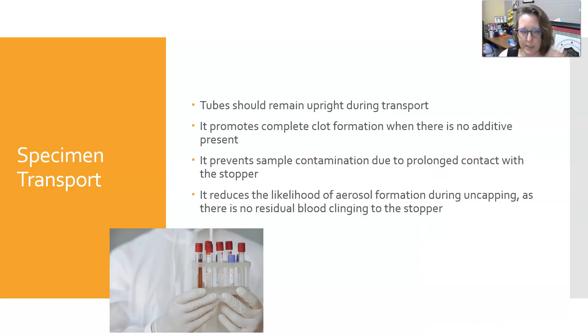Specimen transport itself: the tube should remain upright during transport. That promotes complete clot formation when there is no additive present. It prevents sample contamination due to prolonged contact with the stopper. It also reduces the likelihood of aerosol formation during uncapping as there is no residual blood clinging to the stopper.